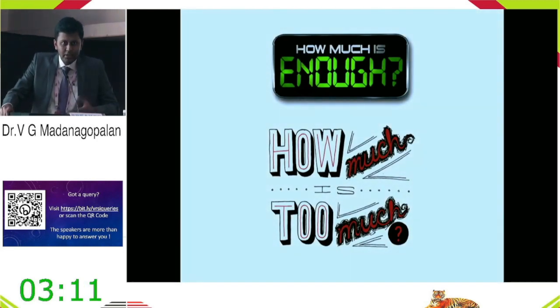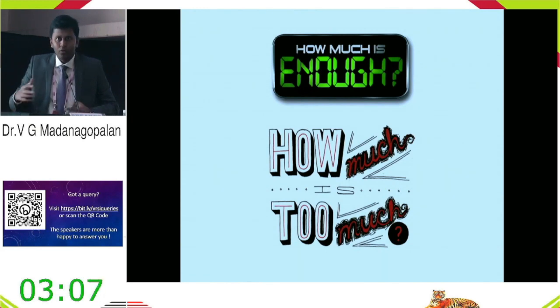I've basically lost count of the rate of cuts these days. But we all know about the concept of duty cycles, where the port has to be open for a certain amount of time to actually grasp the vitreous and remove it. By the look of things, we are going so fast that we are soon going to be skimming the vitreous without removing anything or doing anything meaningful. I'm sure the panel here would agree with me. They would have been trained with 2,500 cut rates and they were doing a good job.